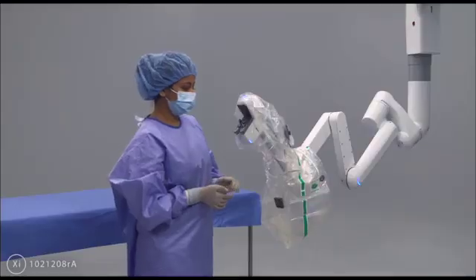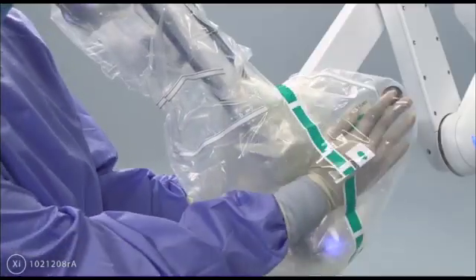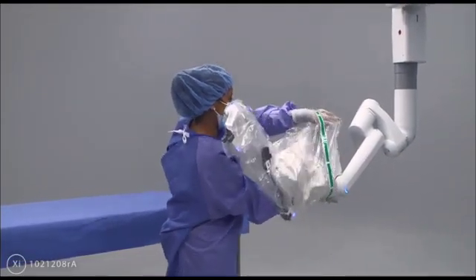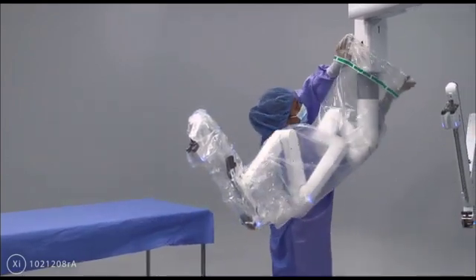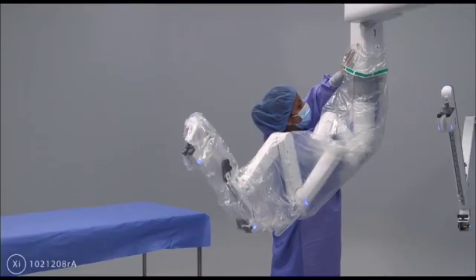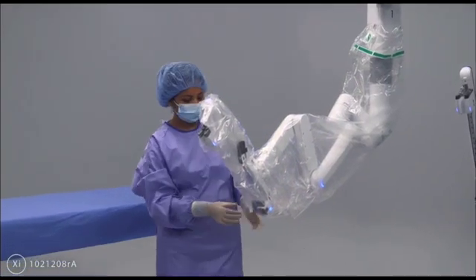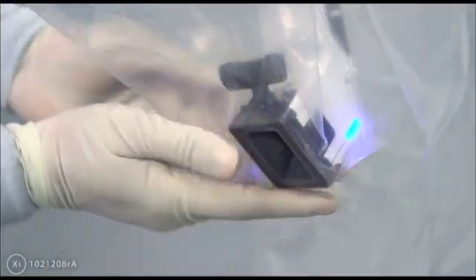Then, placing his or her hands inside the drape cuff, he or she moves the drape along the patient cart arm at the 6 and 12 o'clock positions towards the column. Once the drape is extended over the arm, the sterile staff member attaches both metal discs on the inside of the drape cuff to the magnetic sockets at the top of the arm so that the flex strip is facing the front of the arm. He or she then aligns the cannula mount sterile adapter and clicks it into place.